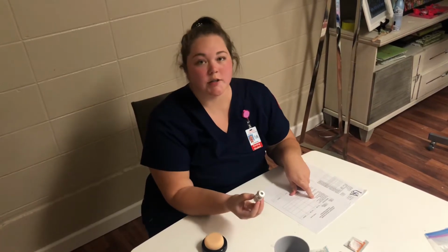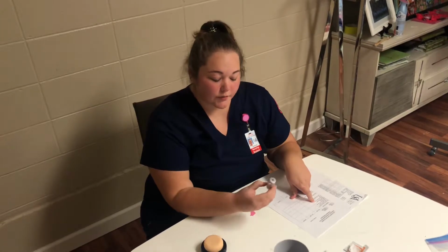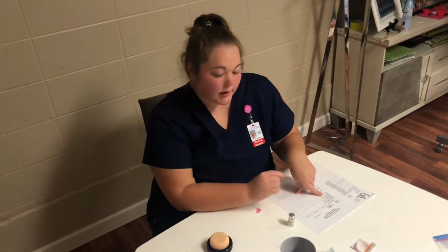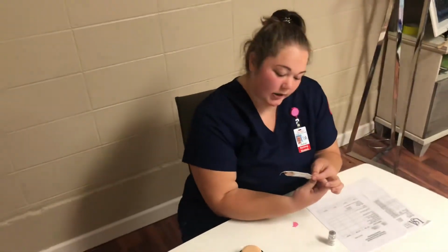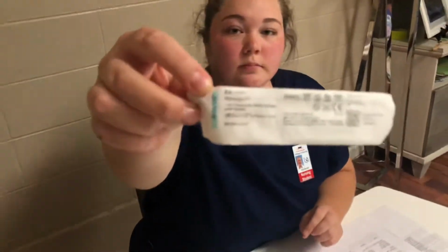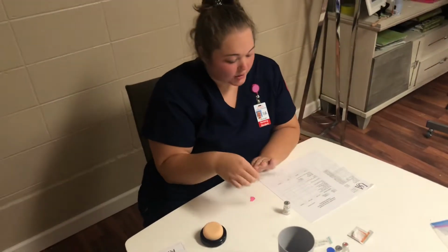I will have another nurse verify that I've done the correct calculation before I give him the injection. So this is to be given subcutaneously. For that, I will be using a 1 milliliter tuberculin safety syringe with a 1/2-inch needle. All right, so that is a subcutaneous needle.